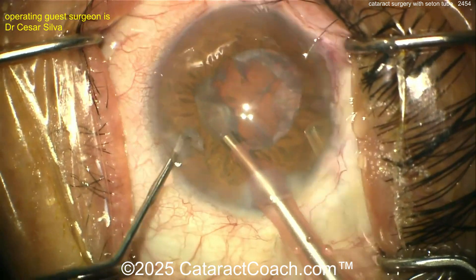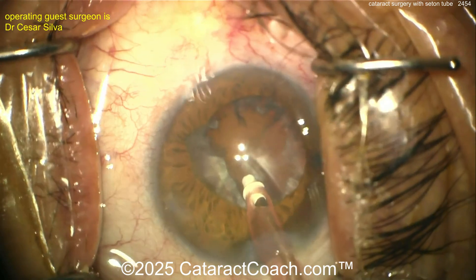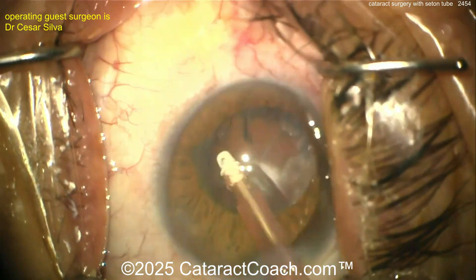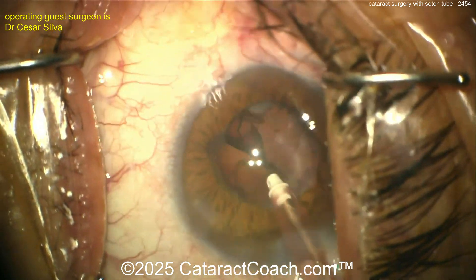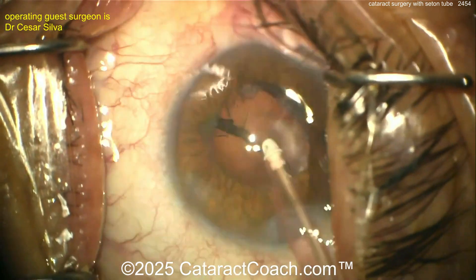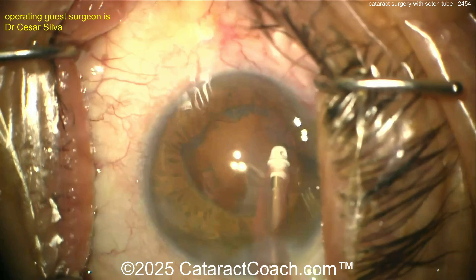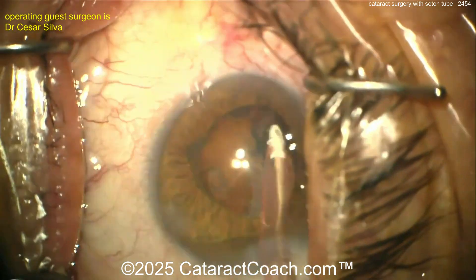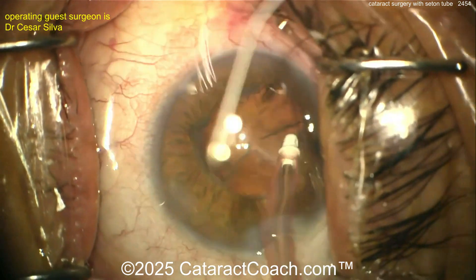In a case like this the nucleus is mostly removed — try to get that epinuclear shell out and then clean up and finish the case. I also like to do one further step: to ensure the continued function of that Ahmed valve or seton tube shunt at the end of the case. When the IOL is already in the bag and surgery is essentially done, put a little trypan blue in the anterior chamber and you can see those particles.